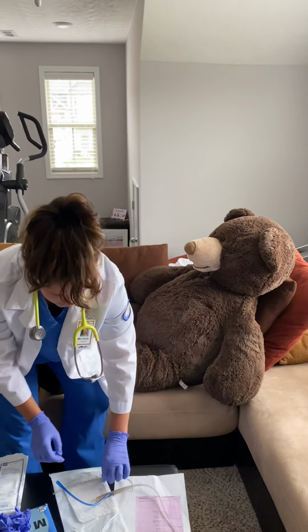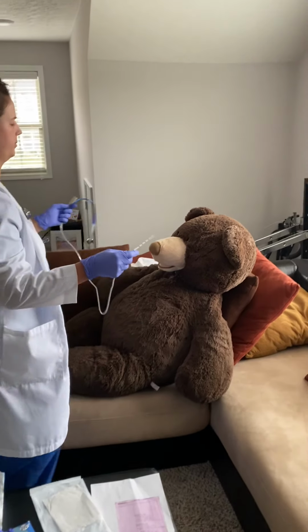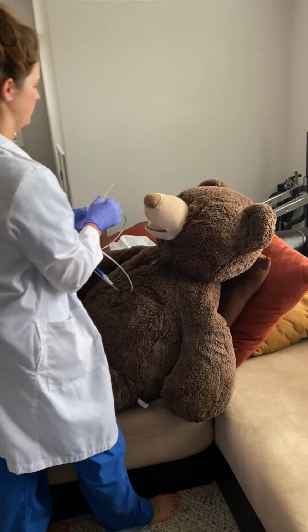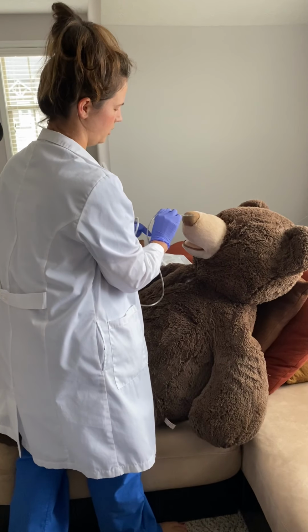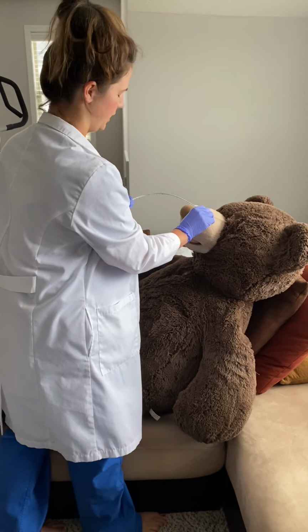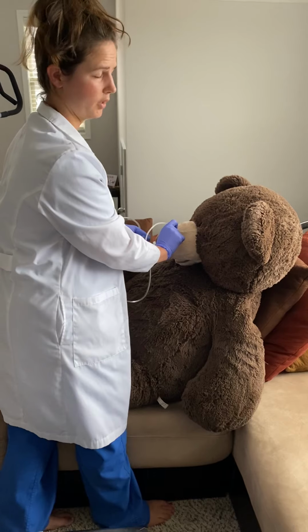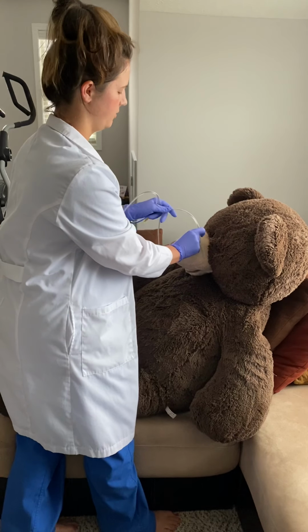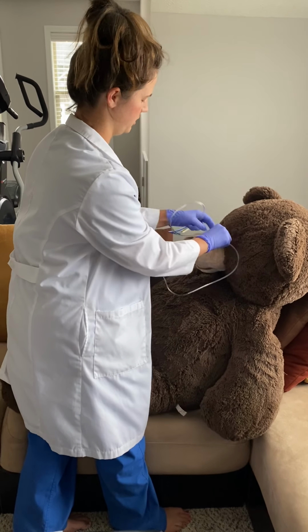And you're going to have some jelly here because you're going to need some lubrication for feeding the tube down. So make sure you put that at the tip. And you're going to tilt your patient's head back to begin with, and just make sure that they're breathing normally, breathing in, and you're just going to wedge it back there until you get to the oropharynx, and then you want to bring the head forward, and you would have assistance at this point with a cup of water with a straw, and your assistant would be encouraging the patient to take sips of water to feed the tube all the way down until you reach that xiphoid process. And then that's where your tape should be.